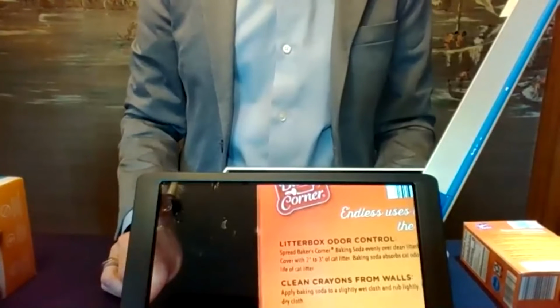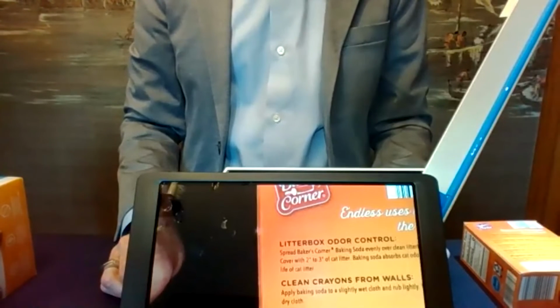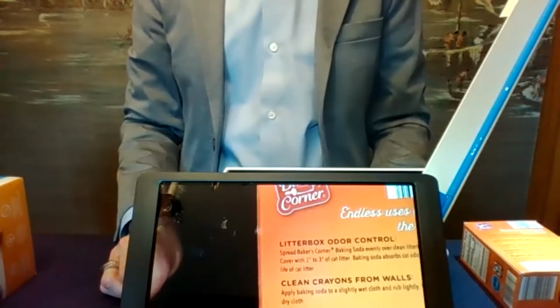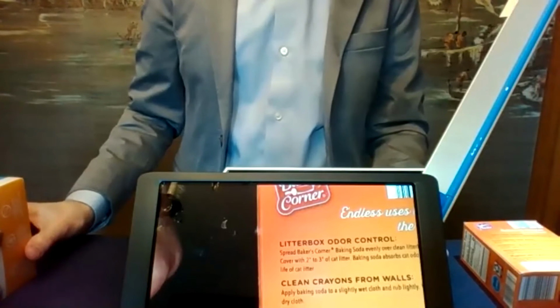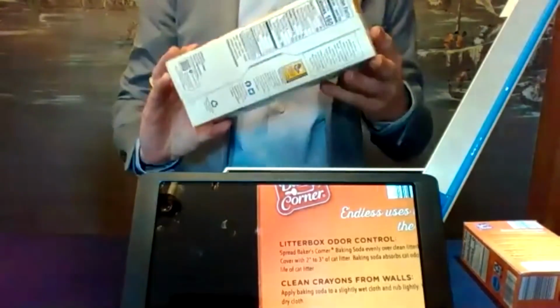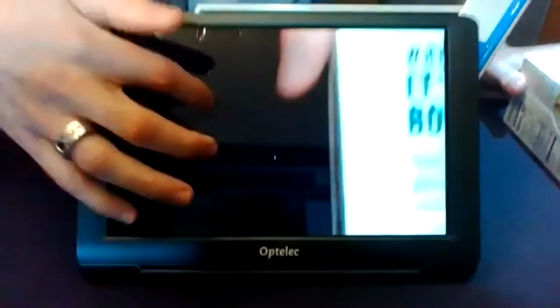So having a fixed position camera like this, where you've got that similar form factor of a desktop, that wide working area under that camera, gives you hands-free access to improve the way you get a hold of that print. And just a perfect case for that too. So here's a box of oatmeal, and under a regular video magnifier, it would be difficult to fit that under there.